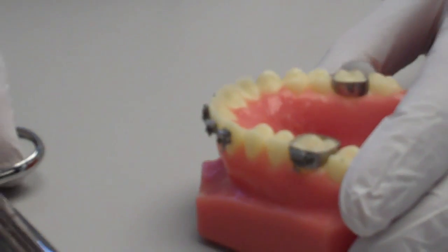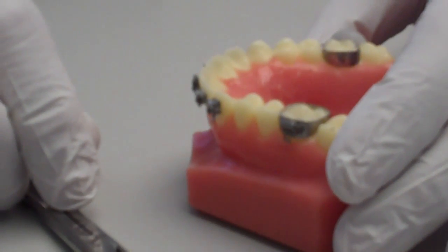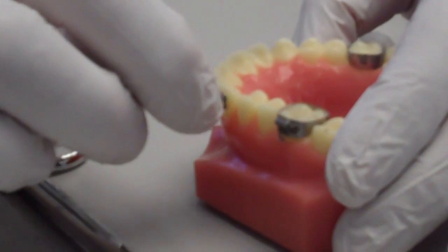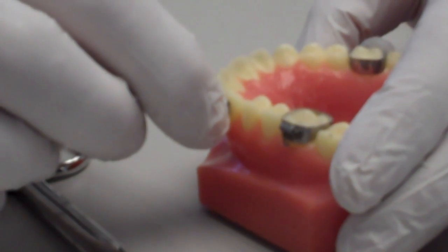If the wire is thicker and it needs to be clipped, a small pair of scissors might not be adequate. You might have to turn to something a little more heavy duty like a wire cutter. If that's the case, make sure again you're clipping as far forward in the mouth as you can and removing the piece of the wire that goes to the back.